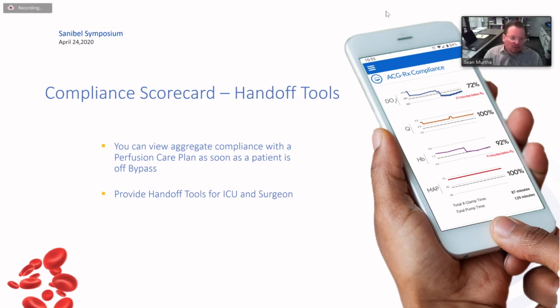Part of our look-see at this on our side is any alerts or alarms that went off, did those kinds of things. How many times do we have high pressures from them lifting up the heart and they didn't think it's our fault, or I can't empty the heart and those kinds of things. So all these things become manageable and a discussion point when you're able to present data to your colleagues. So I think that's really important.